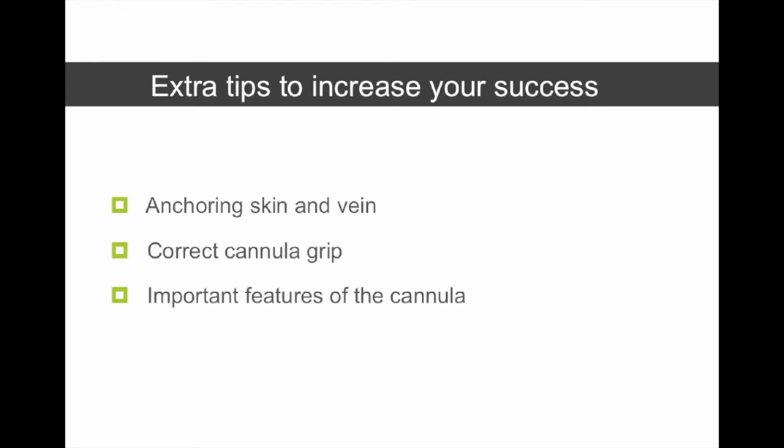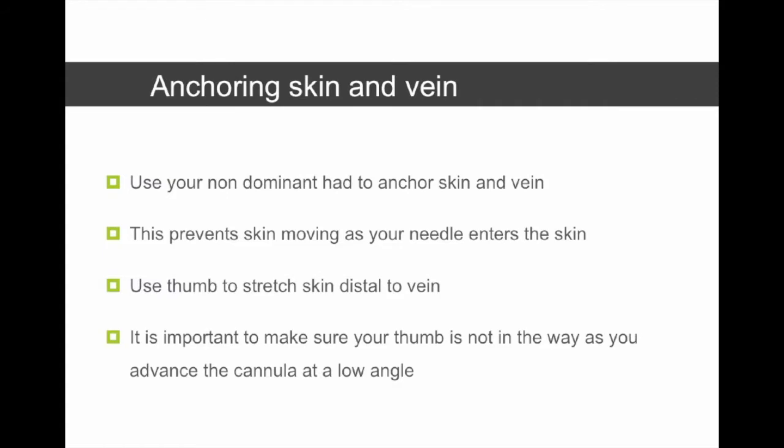Now, let's go through some extra tips to increase your success. Those things include anchoring the skin and the vein, the correct cannula grip, and some important features of the cannula as well. When you're anchoring the skin and the vein, I'll try to demonstrate here.